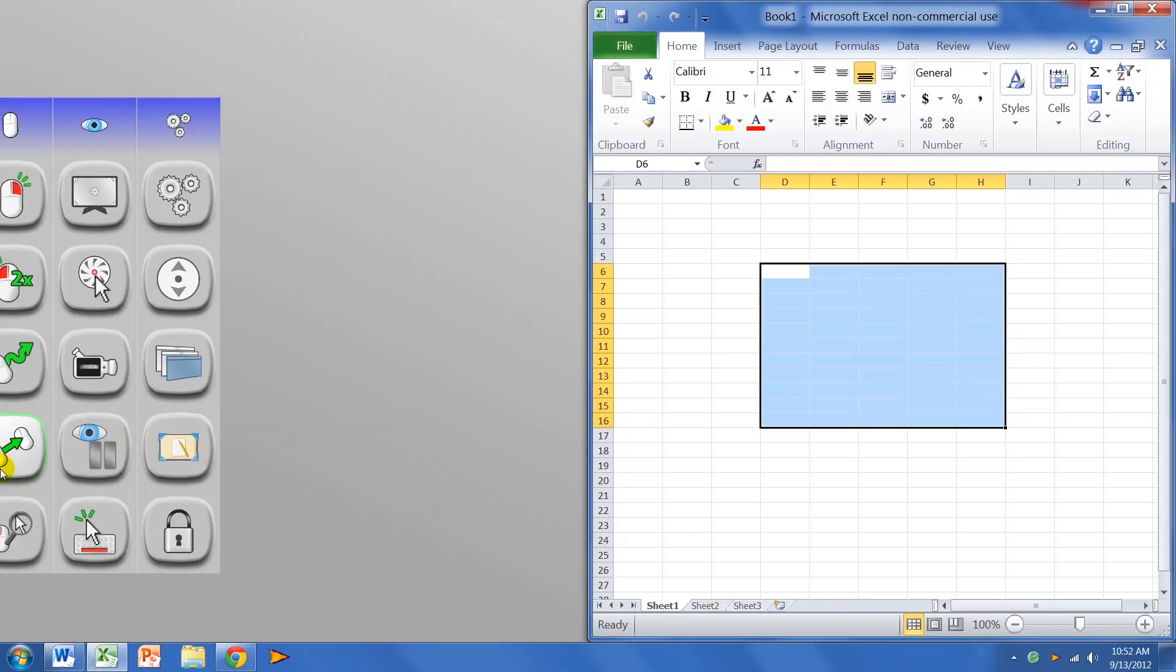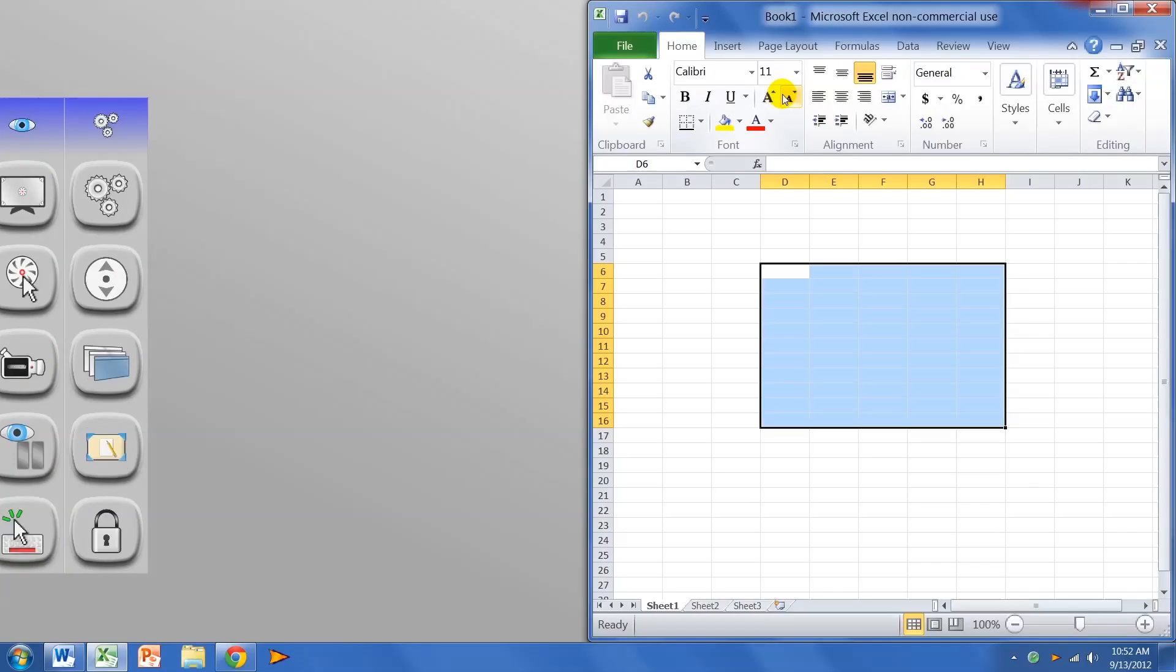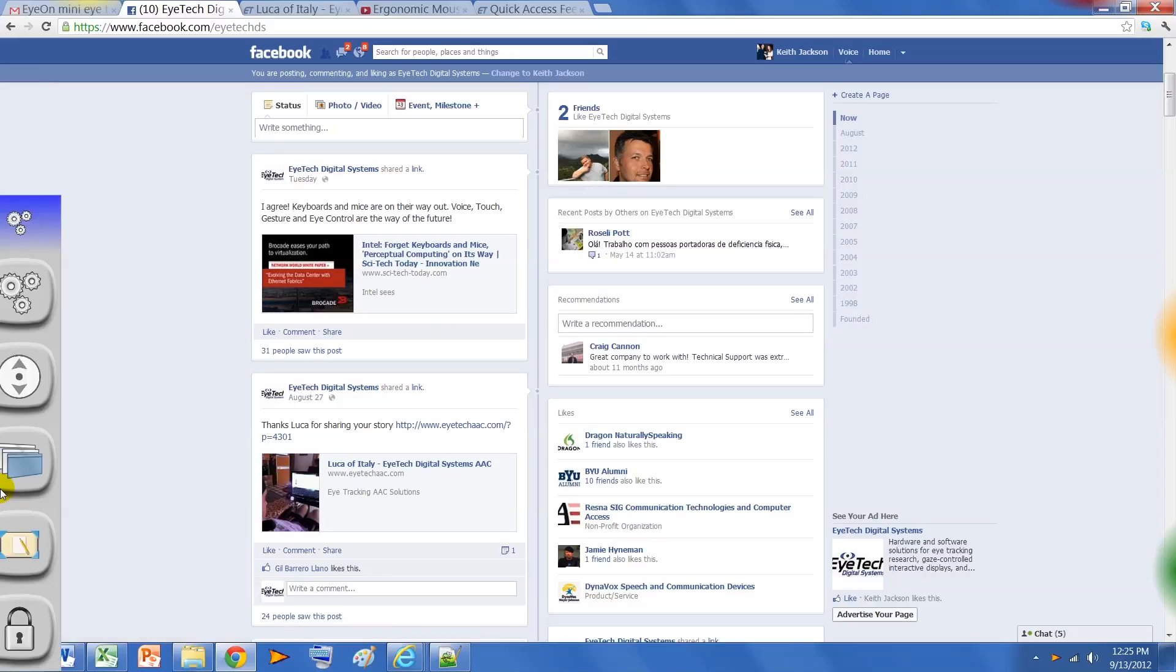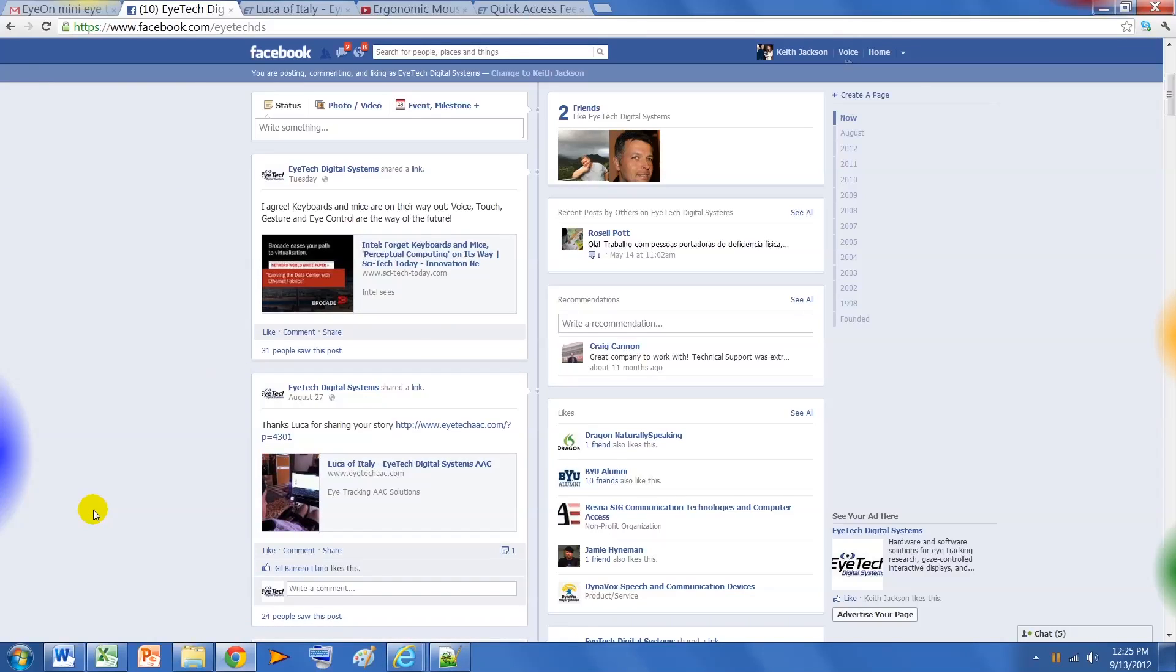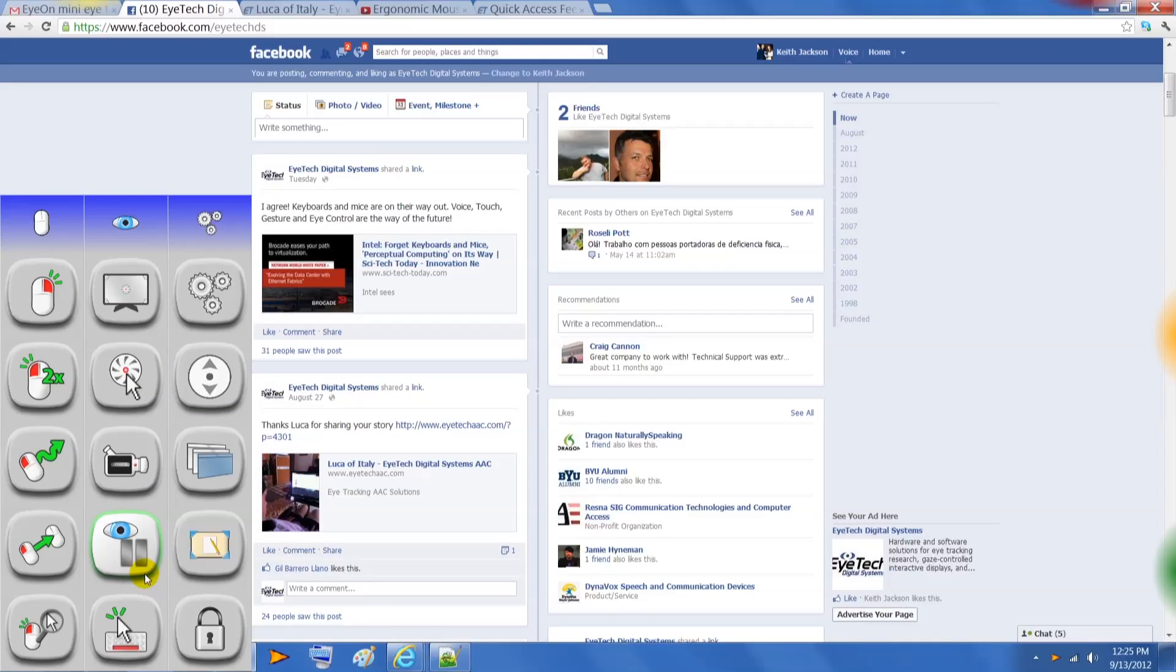Our new zoom feature offers real-time zoom, and is easier to use than ever before. Another feature is our eye pause. This feature is used to hide and disable the cursor from clicking, so you can read a document, surf the web, or just rest your eyes. Simply look over the blue hotspot to reactivate the cursor.